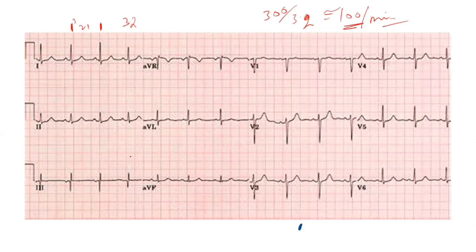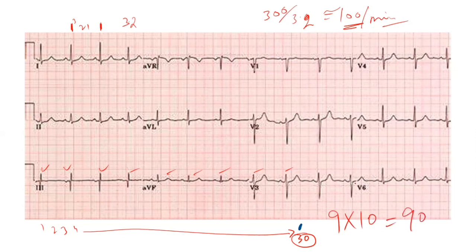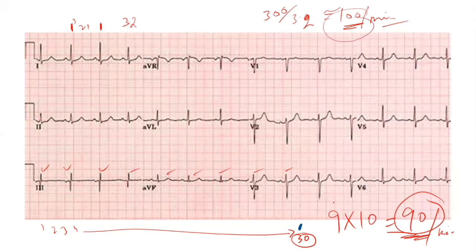For the irregular rhythm method, we look at the bottom lead and count 30 large boxes. Then we count the R waves within that strip: one, two, three, four, five, six, seven, eight, nine — approximately nine and a half. Multiplying nine by ten gives 90 beats per minute. If the rhythm were irregular, the heart rate would be approximately 90 beats per minute.